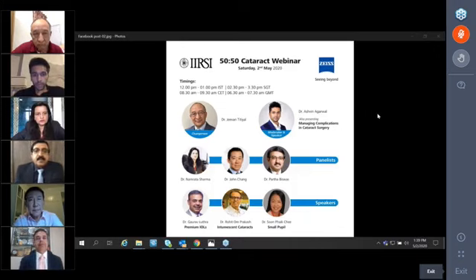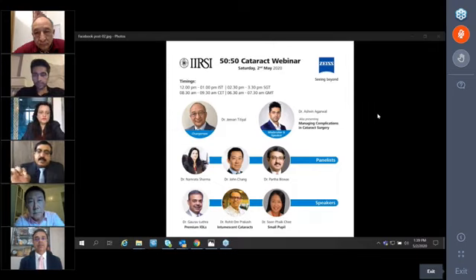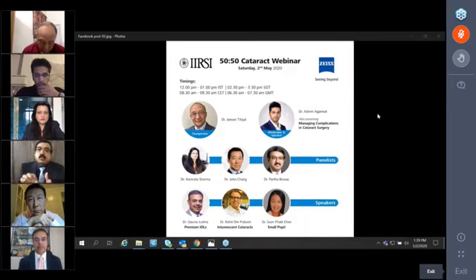Professor Chee showed a very nice way of very elegantly doing a small pupil rhexis, a small pupil management. So the peeling of the membrane on the pupil will definitely damage some amount of the sphincter. And if it is a very small one, like what Professor Chee was dealing with, the possibility of supporting with another Y hook while the peeling is going on is very important. So that gives the counter traction onto the movement of the peeling of that membrane.